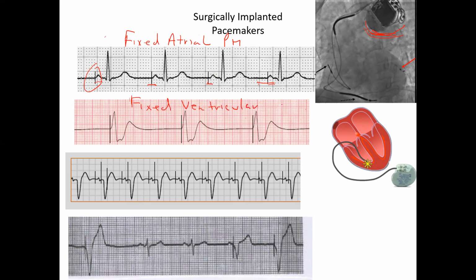And that's coming every time. There's no P wave here, but it's coming before each ventricular beat or depolarization. The next one down is a fixed dual chamber pacemaker.